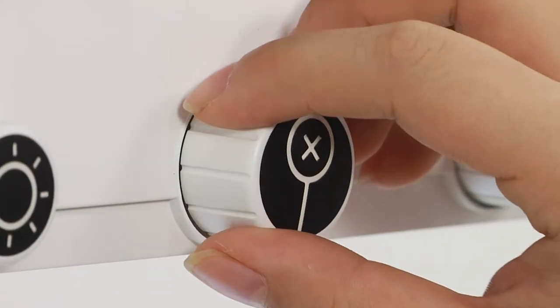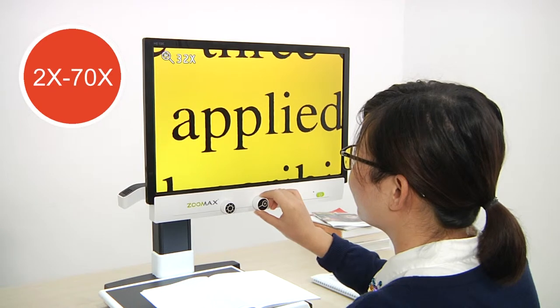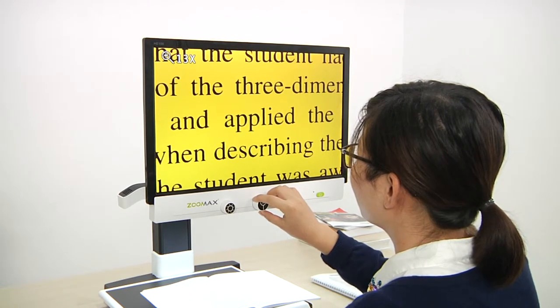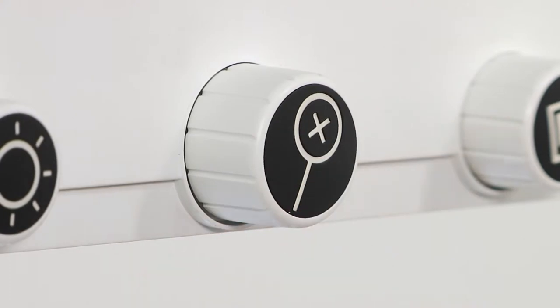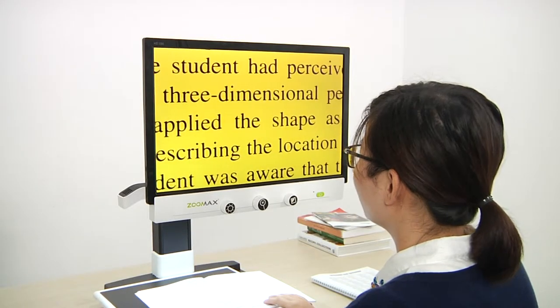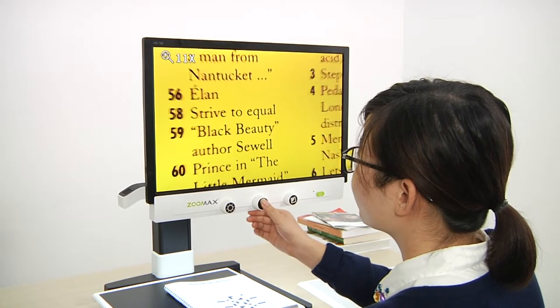Magnification dial: turn the magnification dial to read clearly at a suitable magnification between 2 times and 70 times. If you like, you can even set it as your favorite magnification by long pressing the magnification dial until you hear a beep. It's easy to return to your favorite magnification anytime by short pressing the magnification dial.